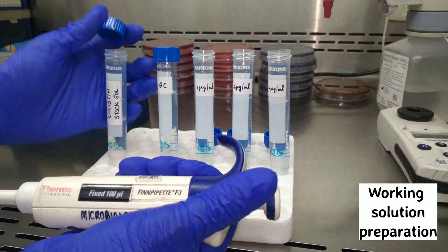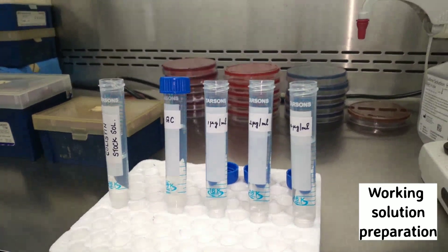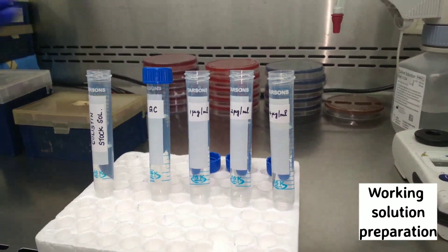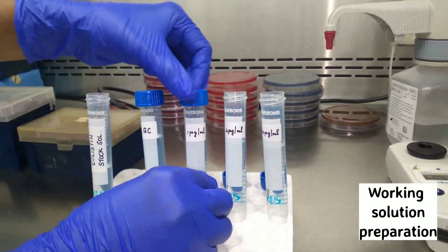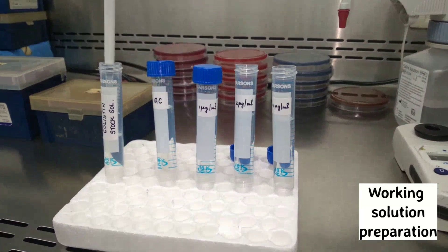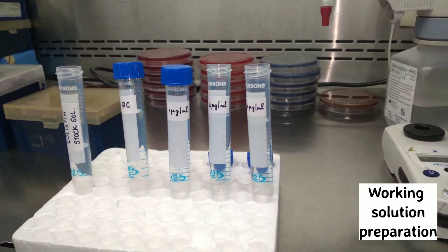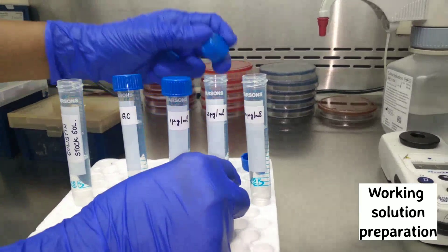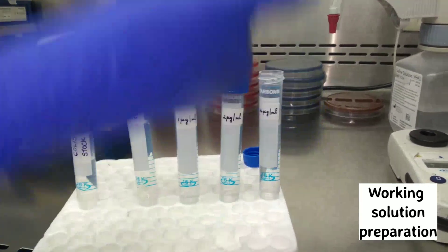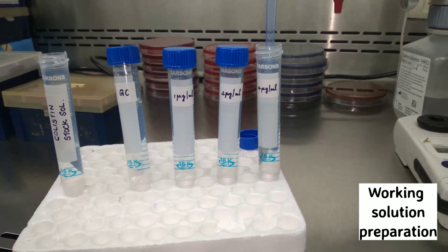Now that we have removed some water, we will replace it with the colistin stock solution. Take 100 microlitres and add it back into the 1 microgram per ml tube. Similarly, take 200 microlitres of colistin stock solution and replace the 200 microlitres withdrawn from the 2 microgram per ml tube, so that the total volume comes back to 10 ml. Finally, take 400 microlitres of colistin stock solution and add it into the 4 microgram per ml tube.